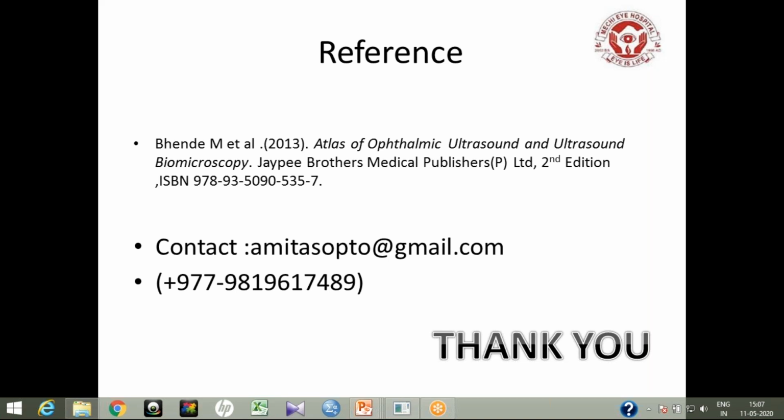In pediatric cases, while doing a scan, we have to comment about globe size also, because in case of cataract, we have to put the lens. Sometimes we cannot do IOL Master in case of a mature cataract in the child, or the child is not very cooperative.